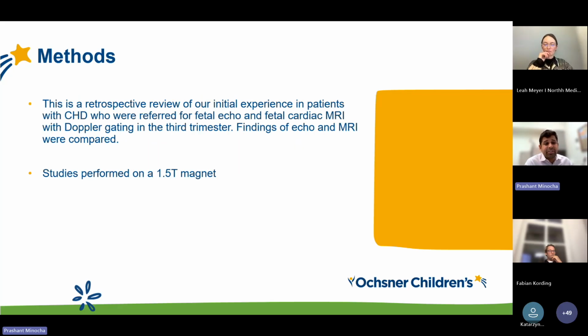This is a retrospective review of our initial experience in patients with congenital heart disease who were referred for fetal echo and fetal cardiac MRI with Doppler ultrasound gating in the third trimester. We used the SmartSync from Northh Medical, and findings of fetal echo and MRI were compared. Our studies were performed on a Siemens 1.5T magnet.